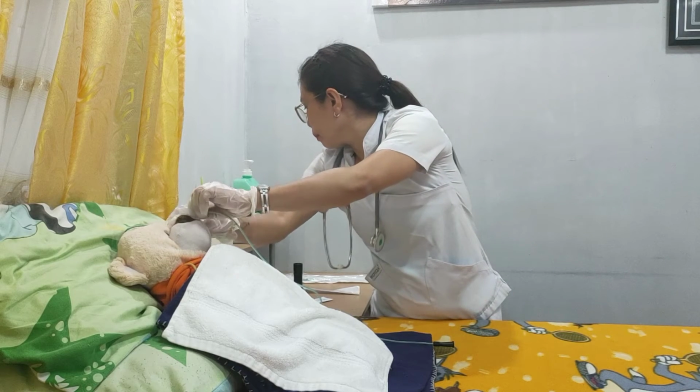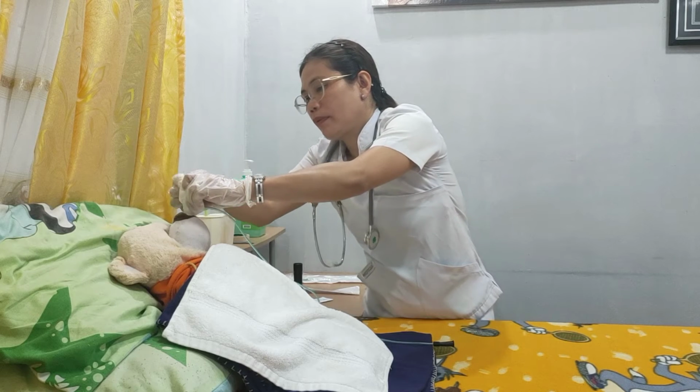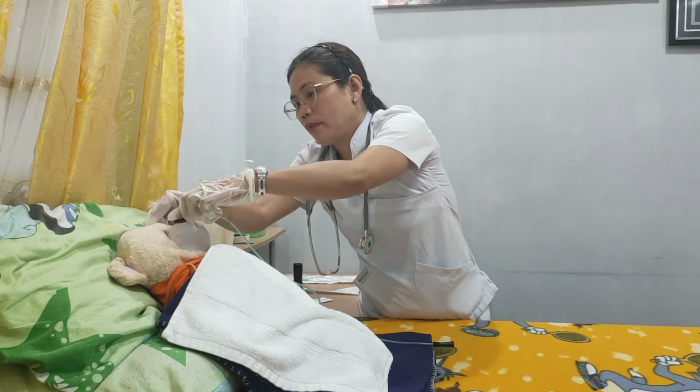And then right after this, secure this with the tape. Take note, be careful not to pull the tube tightly against the nose, because continuous pressure of the tube against the skin and the mucous membrane causes tissue injury.